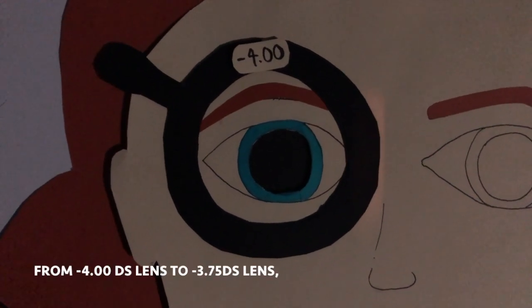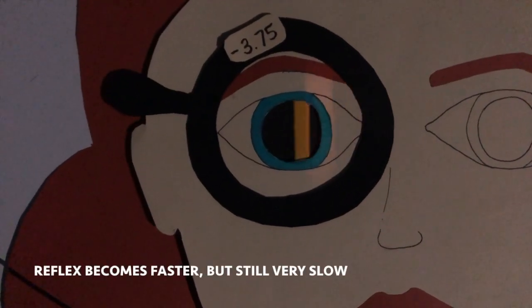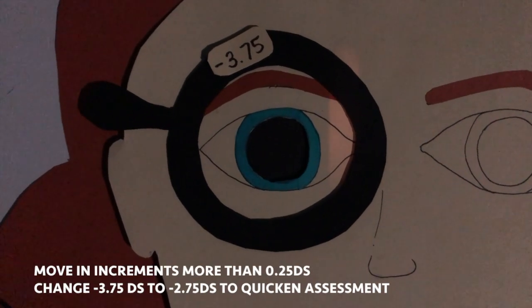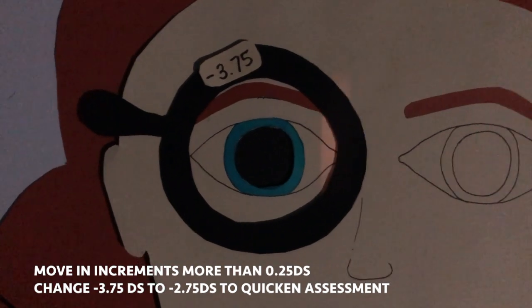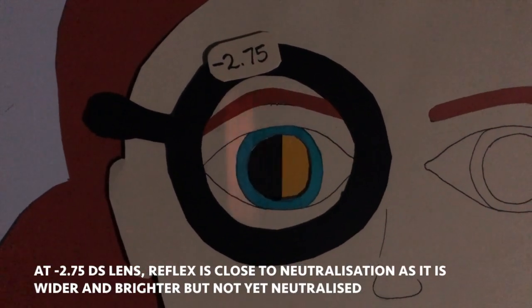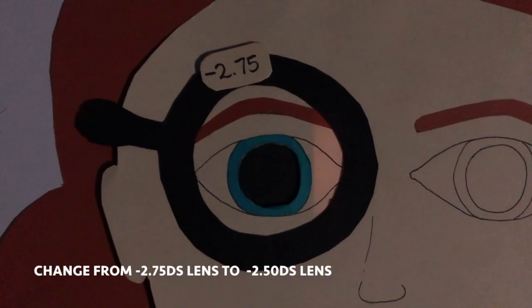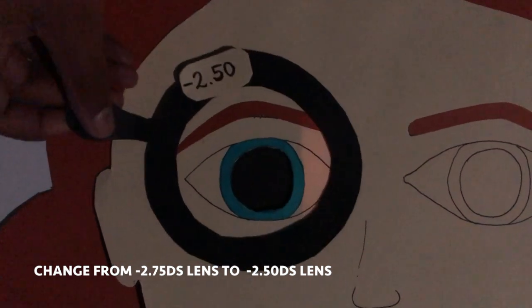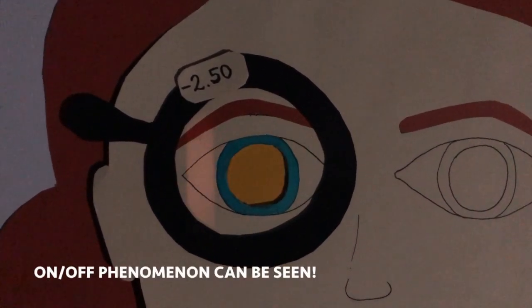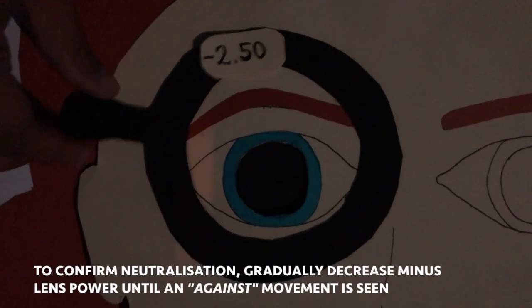Moving from minus 4 to minus 3.75, the reflex becomes faster but is still very slow, so we move in increments greater than 0.25. Adding the minus 2.75 lens quickens the assessment, and at minus 2.75 it is very close to neutralisation but not yet achieved. Adding the minus 2.5 lens, the reflex is faster, brighter, and wider, and the on-off phenomenon is observed. To confirm neutralisation, move down to minus 2.25 and an 'against' movement should be observed.